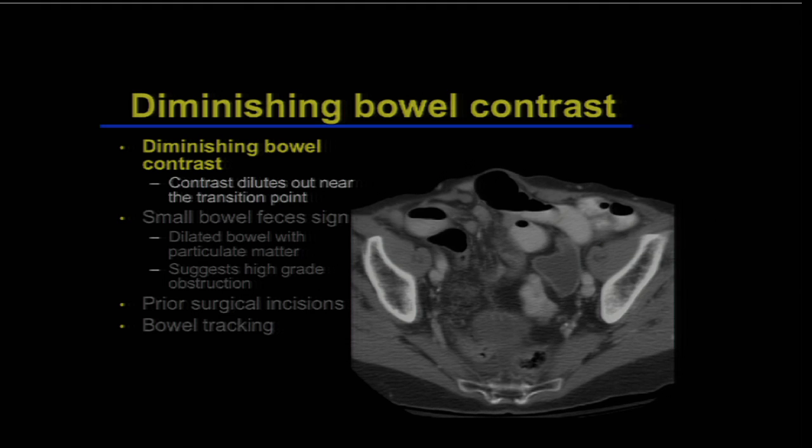So I tell you, this goes against the American College of Radiology recommendations, because there's a concern if you were to drink hypertonic contrast, you may vomit and aspirate. But I'll tell you, these patients are already vomiting, and if we use very dilute contrast agents, which are diluted down below the level of osmolality in the blood, most of our agents now are that way, 20 mils of contrast in a liter of water, and even if the patient were to drink 1 cup and then have emesis of 2 cups of contrast, still some of that contrast will go down and can help find that transition point.